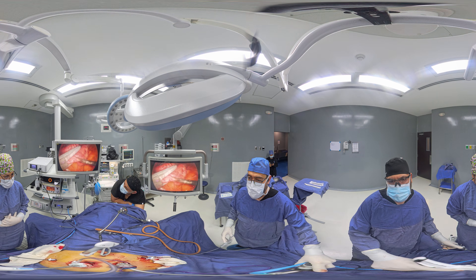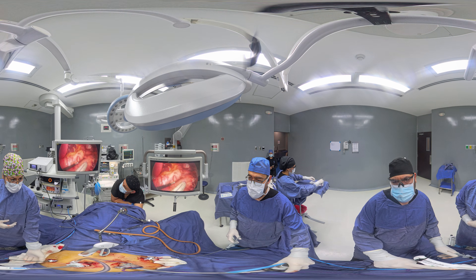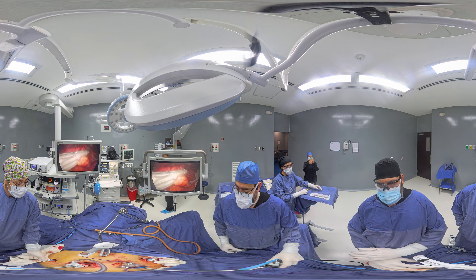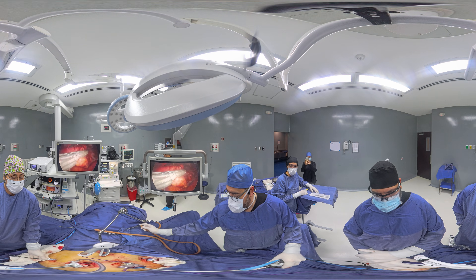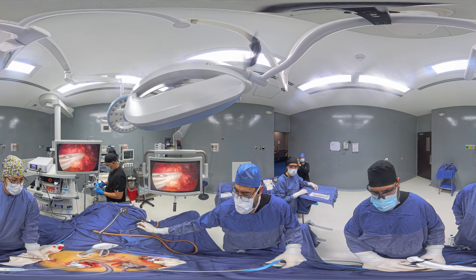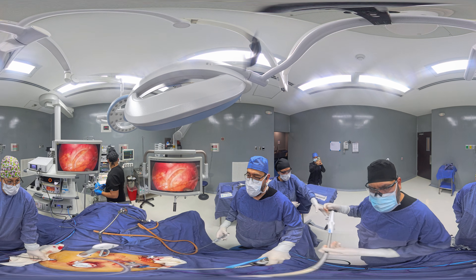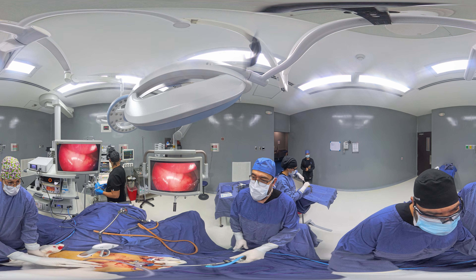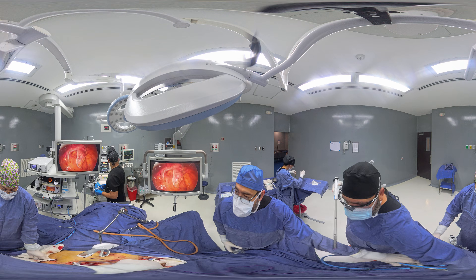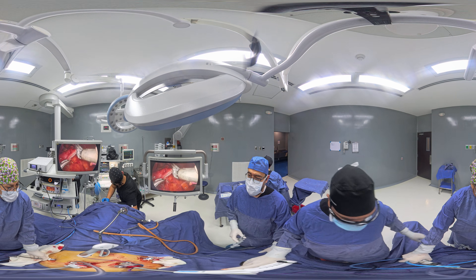First cartridge. The stapler staples both sides and cuts through the middle, as you will be seeing right about here. There it is. Second load.